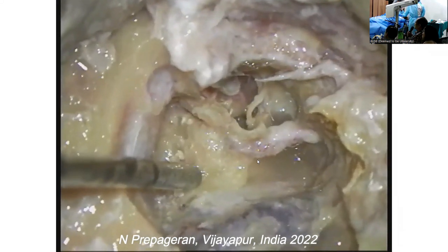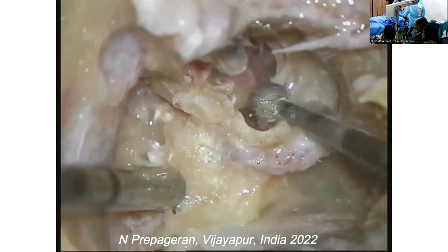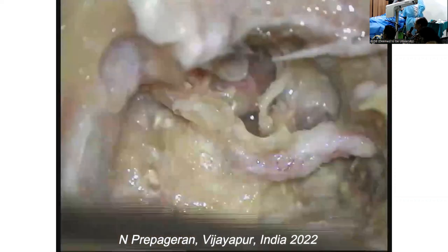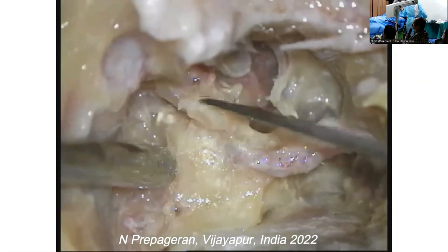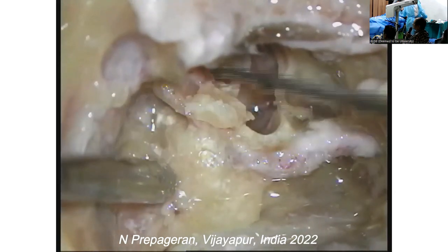That's the incudal pointer to the facial nerve. Round window, you see? You can see how beautifully it's pointing towards the facial nerve here. Yeah, that's the incudal pointer. So I'm going to remove this bone if I can, without dislocating the ossicles if I can.